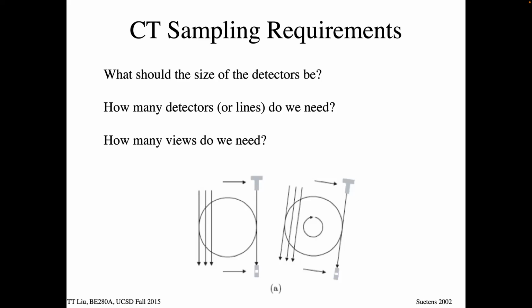So we looked at Nyquist sampling, the rate at which you have to sample a signal digitally in order to capture all the frequencies contained inside it. For us, how many samples do I need across my detector, and how many angles do I need to use to create an image? Obviously, 2 is not sufficient, and 1,000,000 is way too many. So what's the sweet spot in terms of the number of angles that we're going to use?